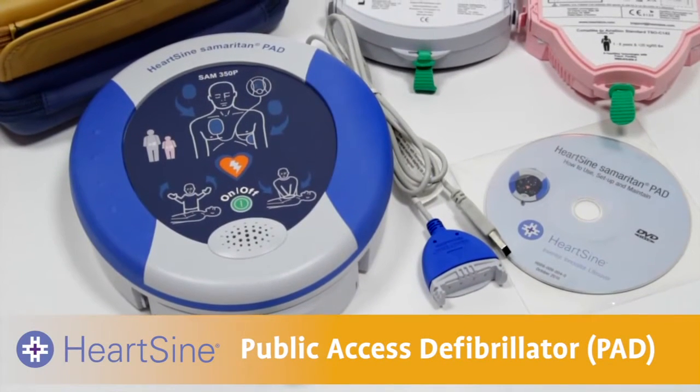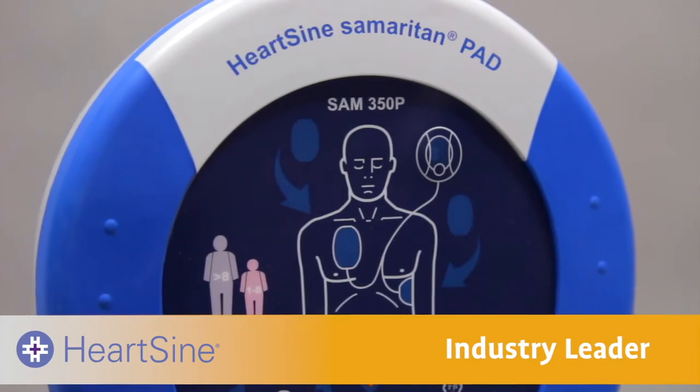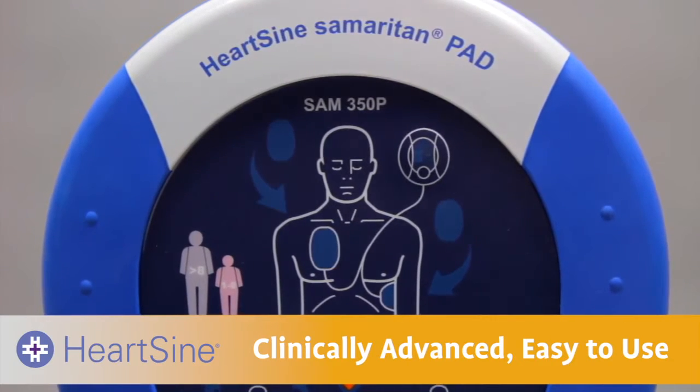Thank you for purchasing a HeartSign Samaritan Public Access Defibrillator, or PAD, the industry leader in clinically advanced, easy-to-use, public access defibrillators.